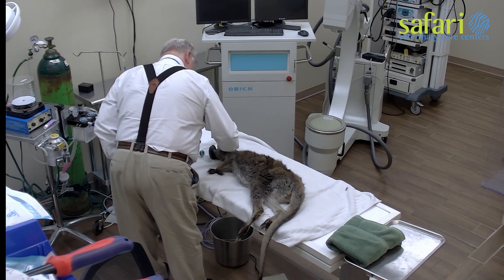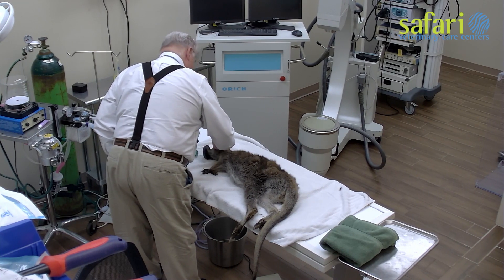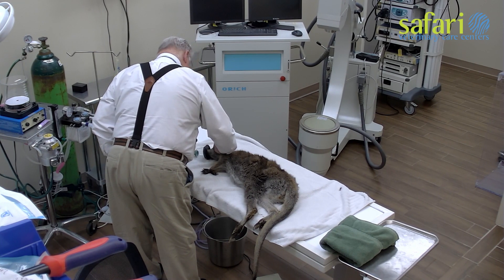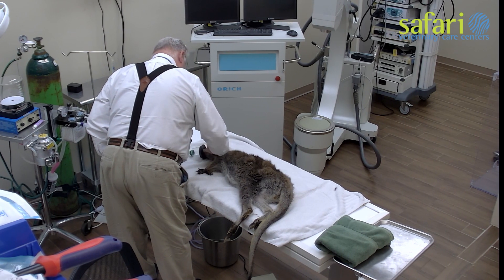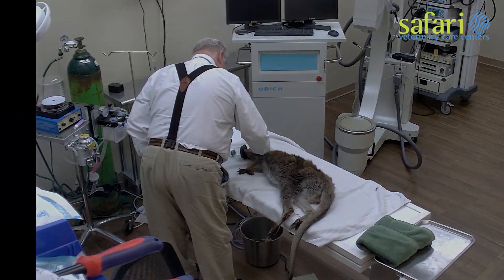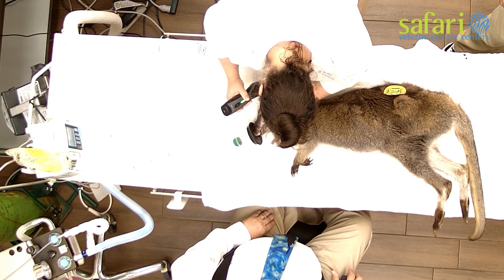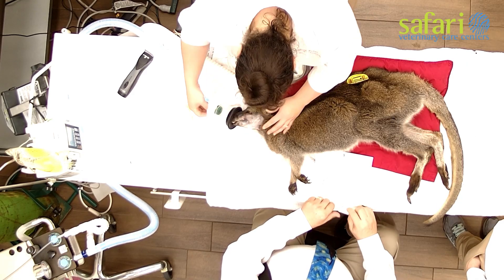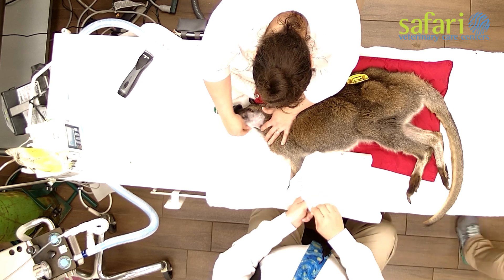Dr. Garner is examining the wallaby, evaluating its jaw, and determining the surgical approach. The surgical site is shaved, cleaned, and scrubbed. This is indeed an abscess.